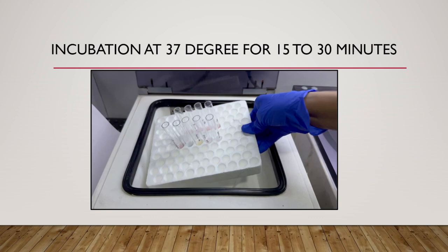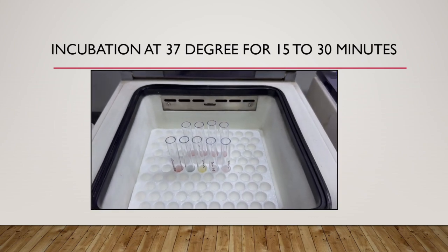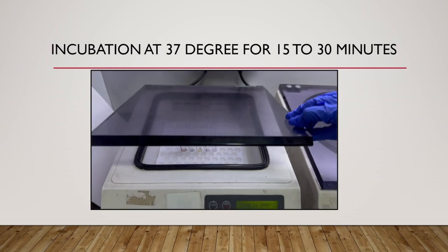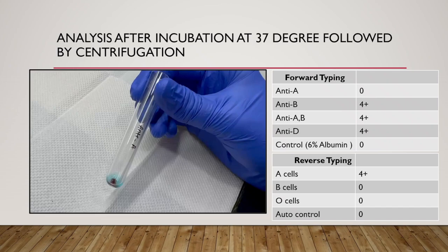Here we are transferring all the tubes of both forward and reverse grouping to an incubator, and we will be incubating them at 37 degrees Celsius for a duration of 15 to 30 minutes. Following incubation at 37 degrees, we will be proceeding to centrifugation, and after the centrifugation, we are going to analyze the results we have obtained.